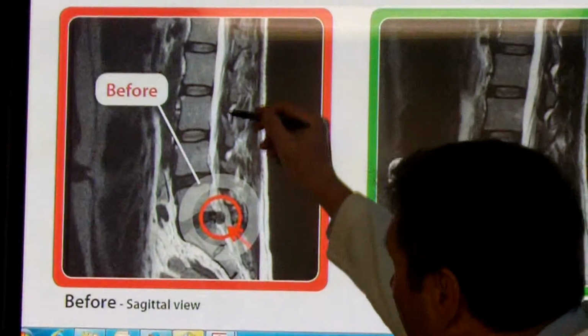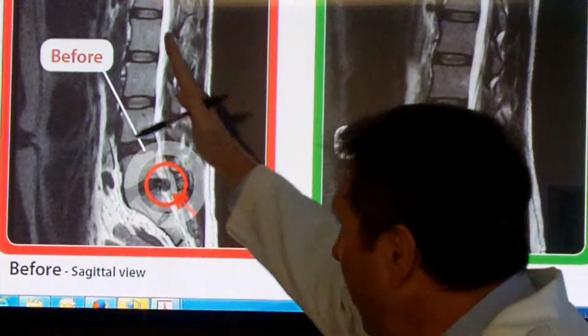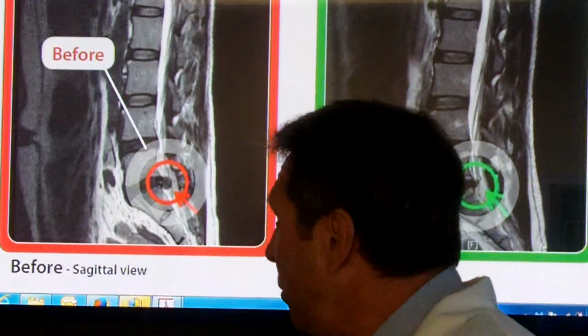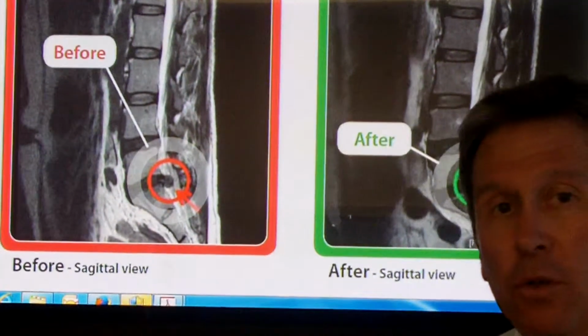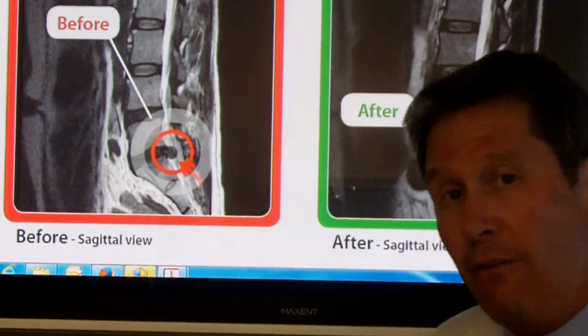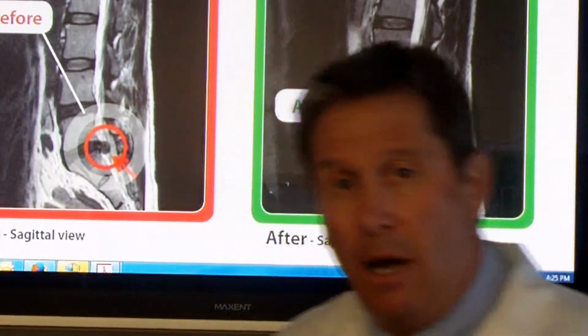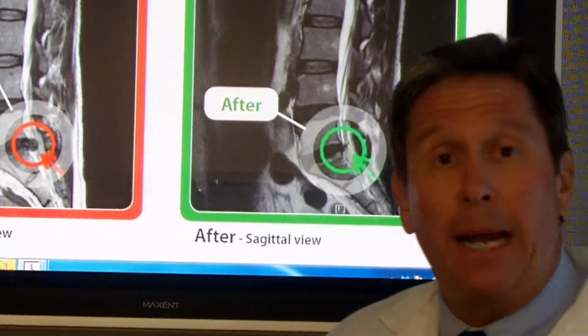We surmise that it was the assistance of the posterior longitudinal ligament as the spine was being pulled into more of a kyphosis instead of the normal lordosis that was actually assisting the vacuum effect of decompression in pulling that extruded portion of the disc back into place.